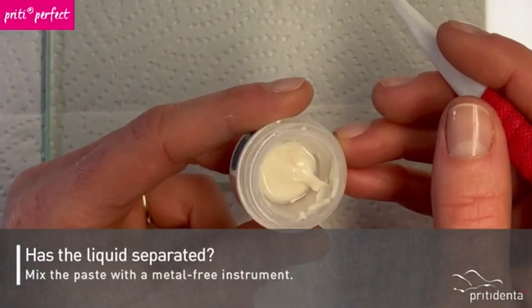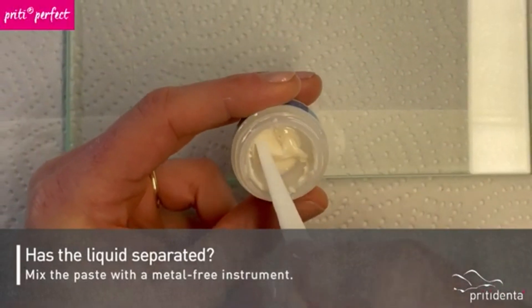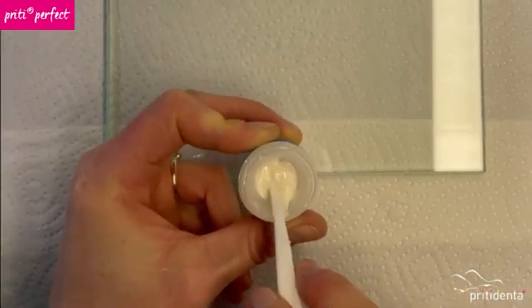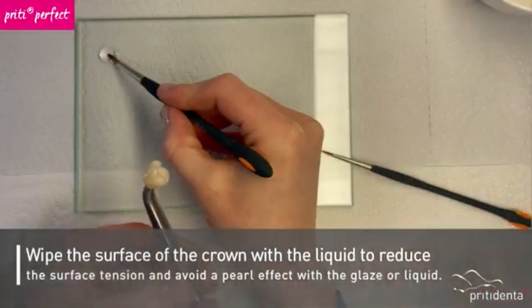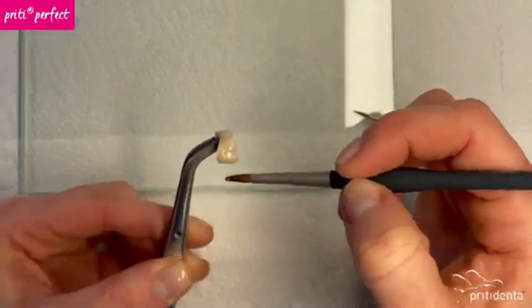Before use, take a look inside the container. If the liquid is separated, mix the paste with a metal-free instrument. Before you begin, brush the surface of the crown with some liquid to reduce the surface tension and prevent the glaze or the liquid from creating a pearl effect.